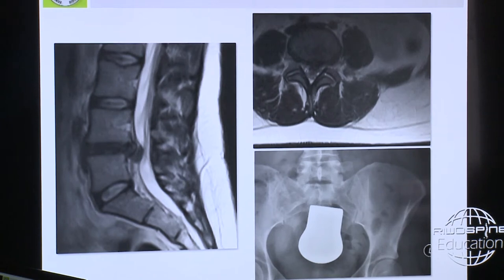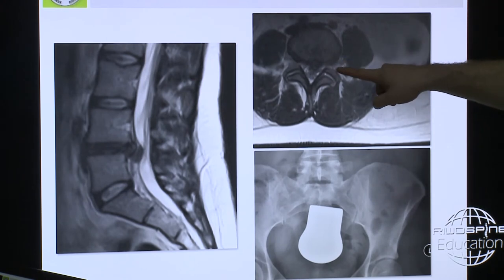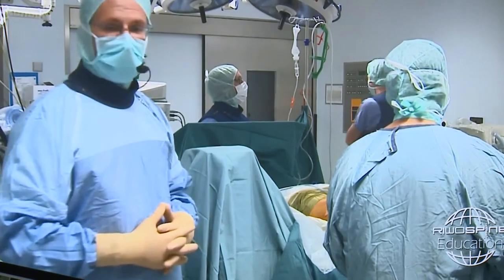We see the pathology is nearly in the middle of the spinal canal. Here we have the exiting nerve root, which we can pass, so it shouldn't be a big problem, but we will see what happens during the operation. This is the exiting nerve root, and you have space here to go in.